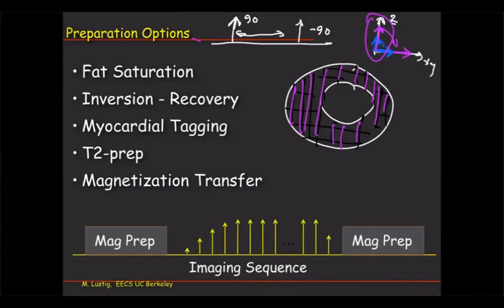This is very subtle here, but actually it's not going to work if there's off resonance, because this is really T2 star, not T2, right? So if you really want to do it, you actually have to put a spin echo here as well. So another 180 actually here, and then that's going to work. Okay, so this is T2 prep.